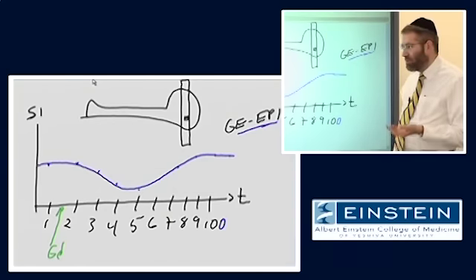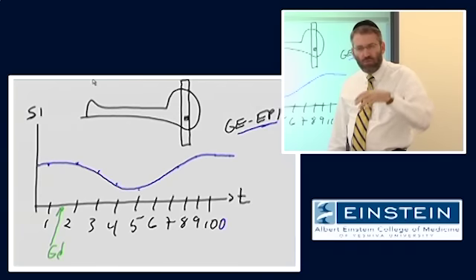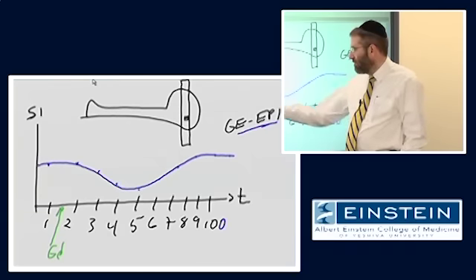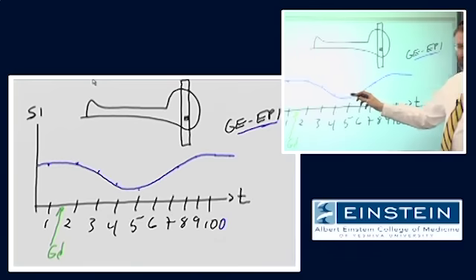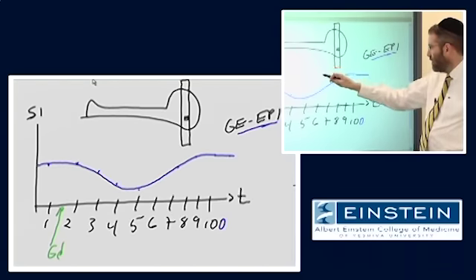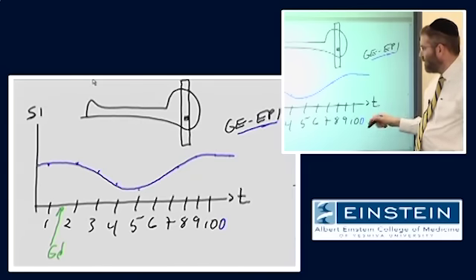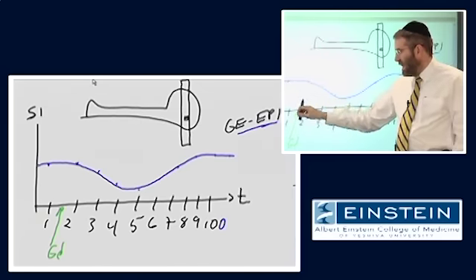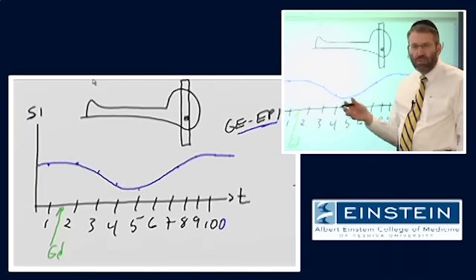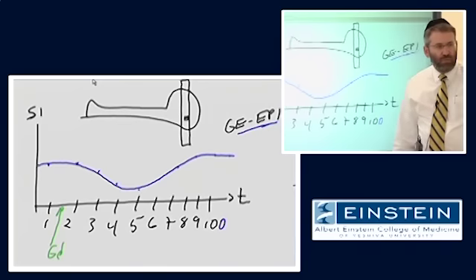Because let's say we just hang it up in a bag and let it drip into the arm. What's going to happen? The slope of this change is going to be broadened. If we want to observe this type of an effect, ideally we want to provide this contrast instantaneously, which is never realistically achievable.